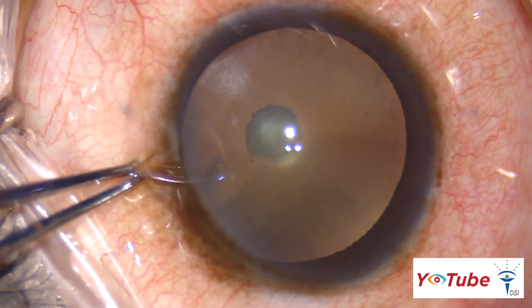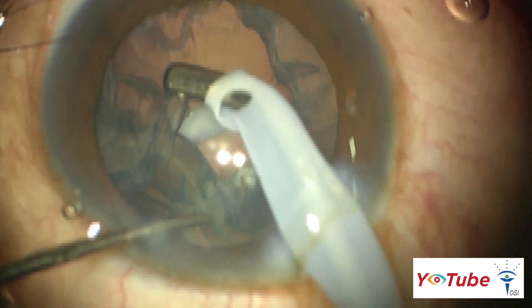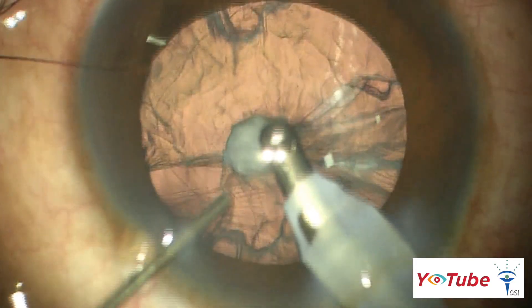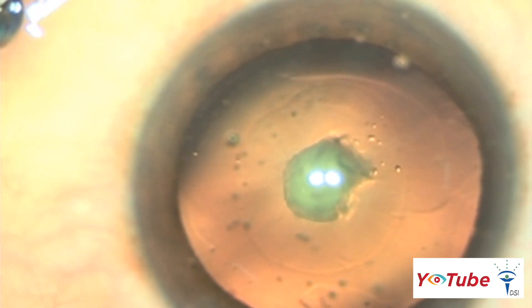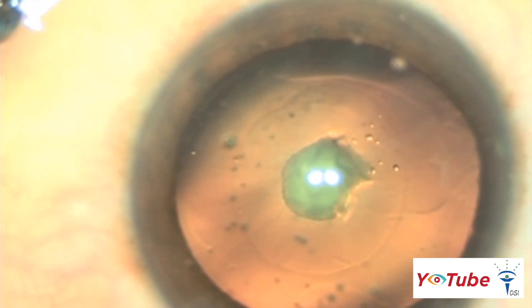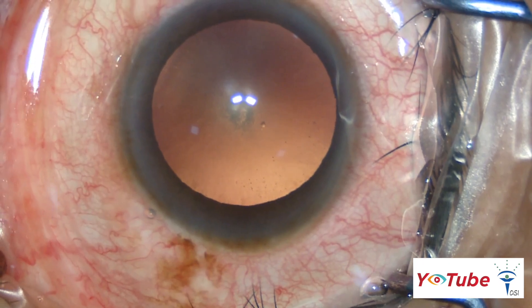Posterior polar cataracts are challenging even for skilled cataract surgeons due to the high risk of posterior capsule rupture and vitreous loss during cataract surgery. In this video, we will describe the necessary precautions to be taken to prevent and manage such complications.